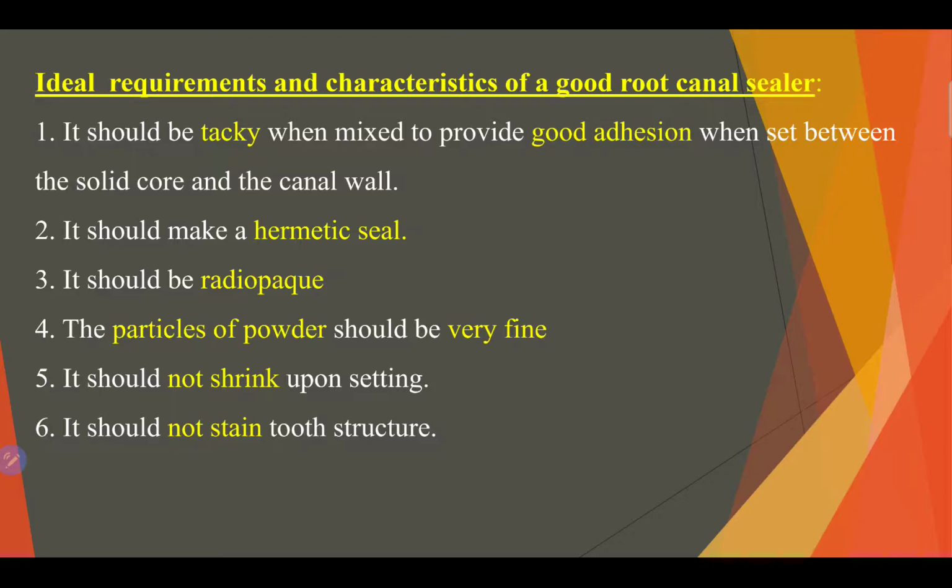And when you make a mixing, the particles must dissolve. If after mixing you see the particles of the powder, that means this is a very bad sealer. If the particle size is so big and it didn't dissolve in the solution, this is a very bad sealer, so you have to put it aside.